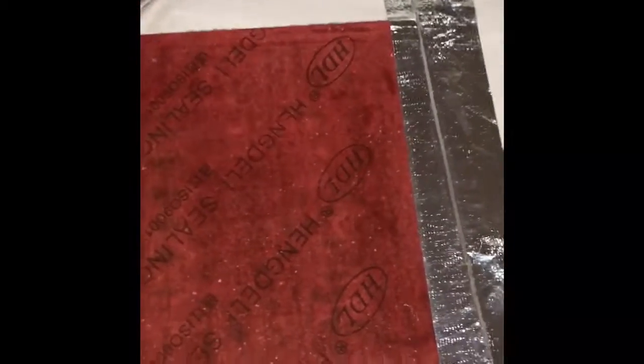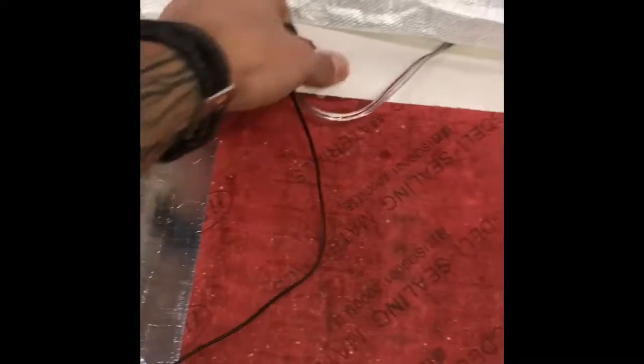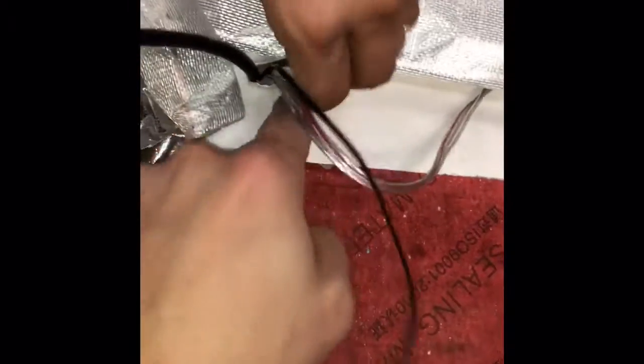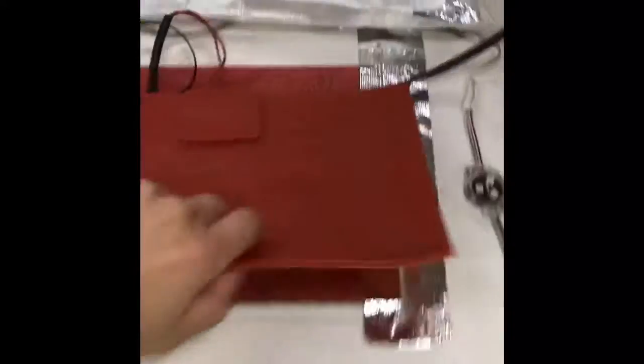So we're gonna pull out the wire. There's gonna be a zip tie right over here. You want to cut the zip tie. Just be careful while you're cutting it. You don't want to cut any other wires. So once the zip tie is cut, you could take the whole heating pad with its wires out.